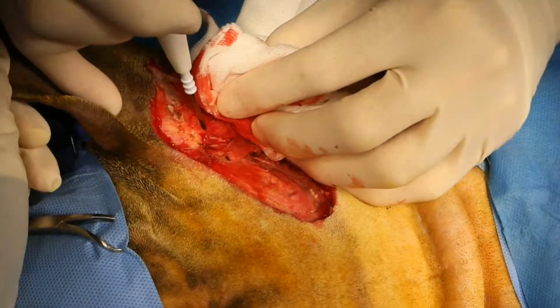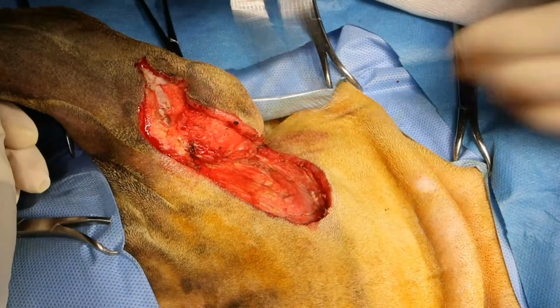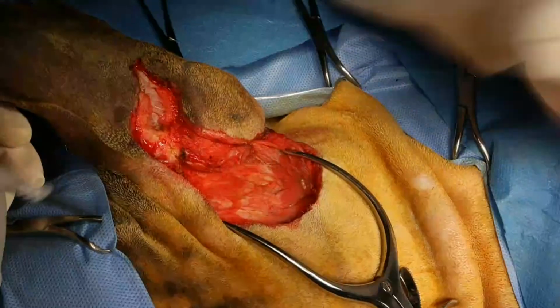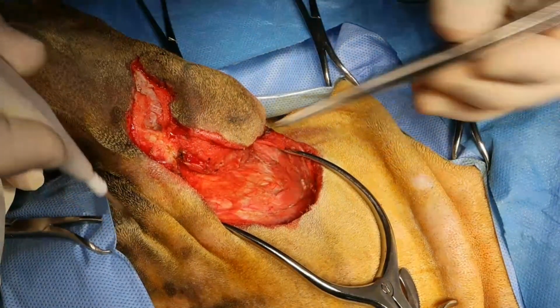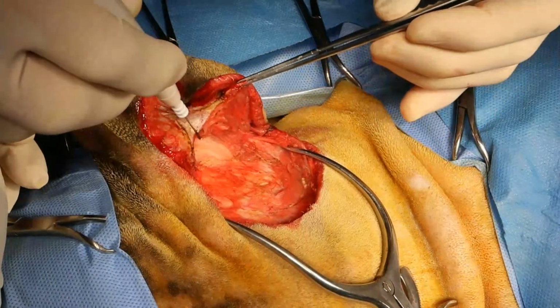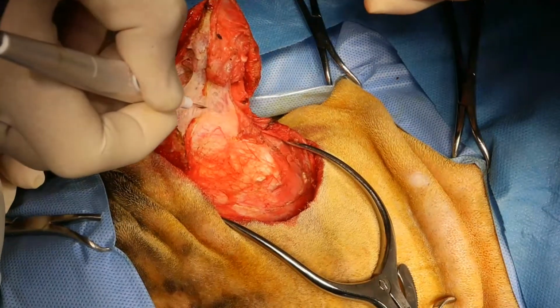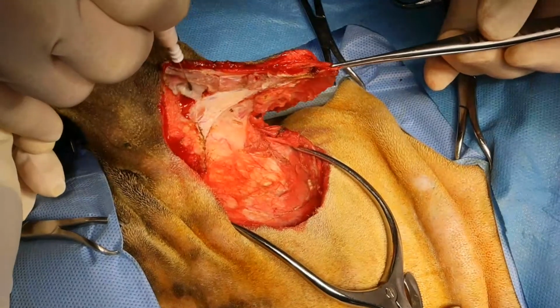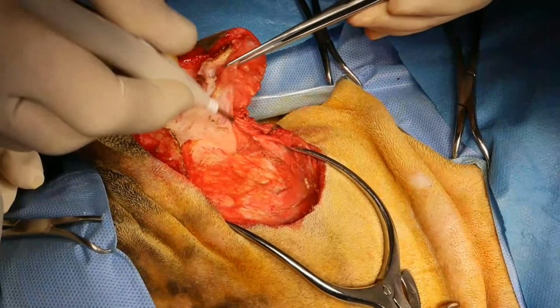One for now. All right, so this is one of those auricular vessels there.